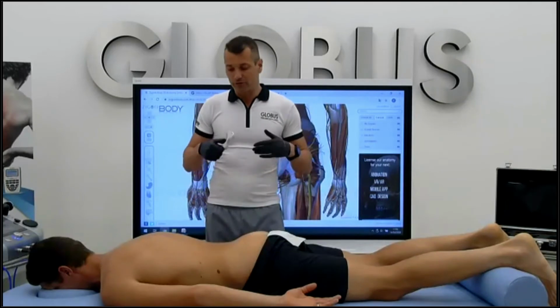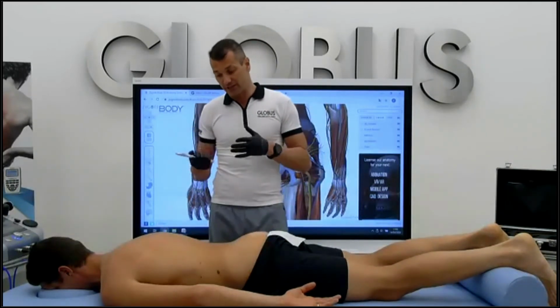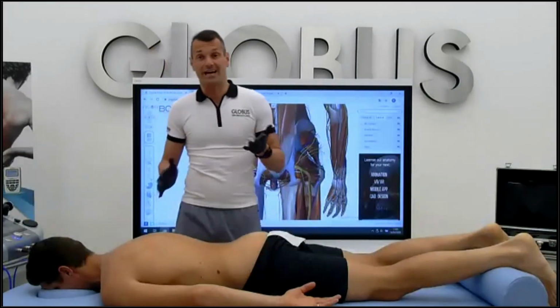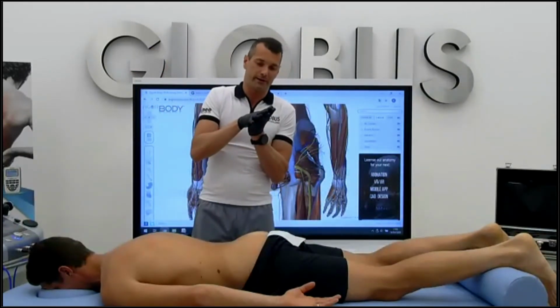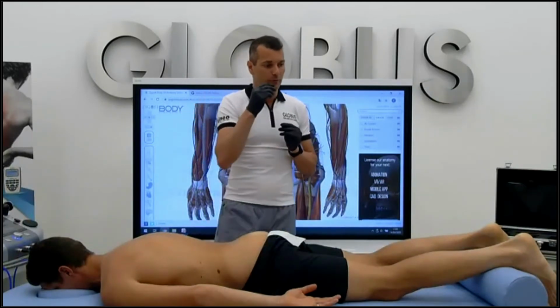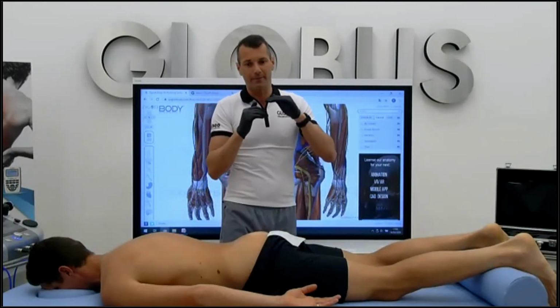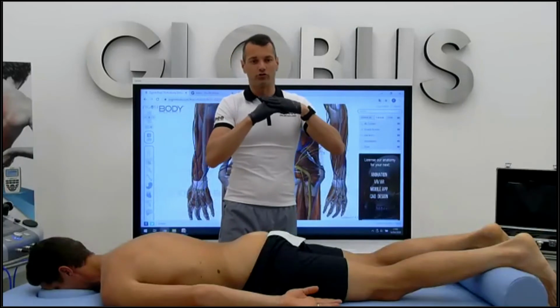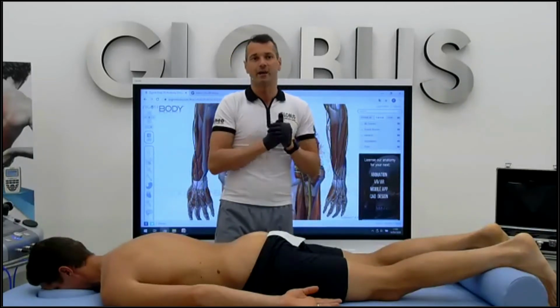Okay, so depending on the force that we put and depending on the target and the objective, sometimes the petechia are a good sign because we have a disgregation. We solve the knots that connect the epidermis with the first layers of fascia. So we are going to promote the right sliding on tissues.